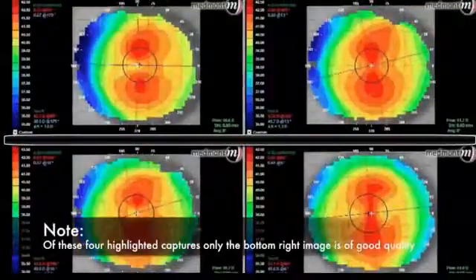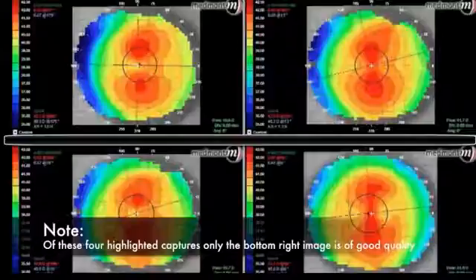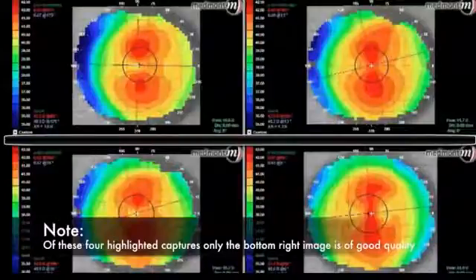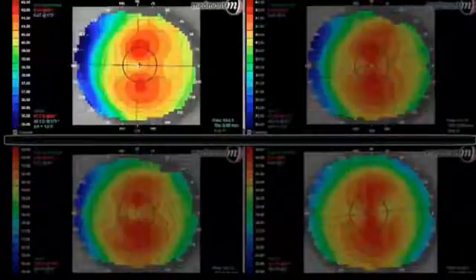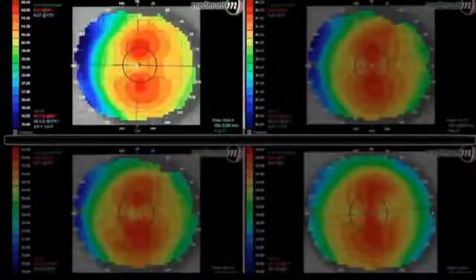If we look at the top left map, we see the blue colour is on the nasal side of the left eye. This means that the peripheral rings are not centralised within the limbus.